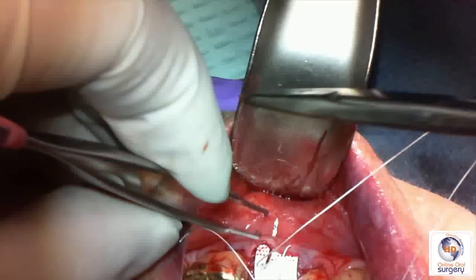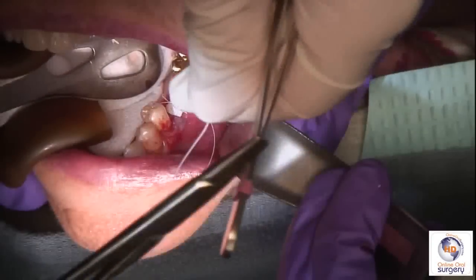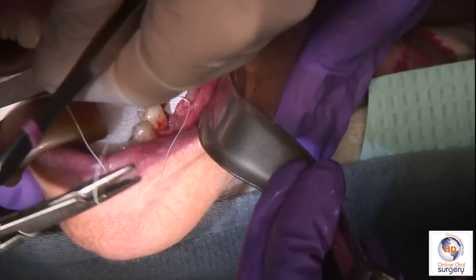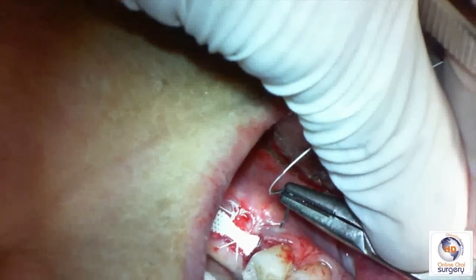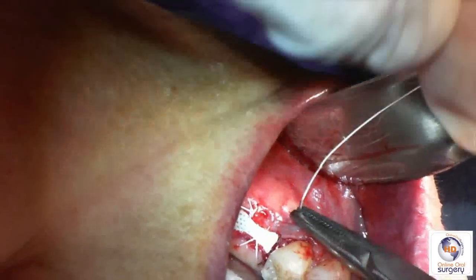The reason I like to do it this way is that if you catch the membrane at all with the needle, rather than pulling the membrane out, it actually helps pull the membrane down in. So then we're going to tie our surgeon's knot to secure the membrane in place. The Cytoplast suture is a little stiffer and has a little more memory than a silk suture, so I always put an extra throw into it — a total of four throws rather than three.